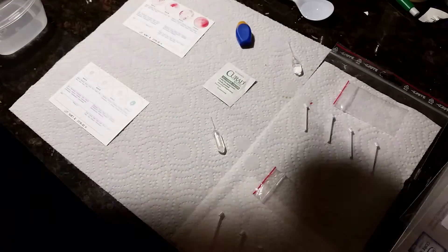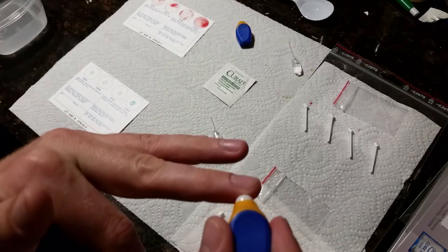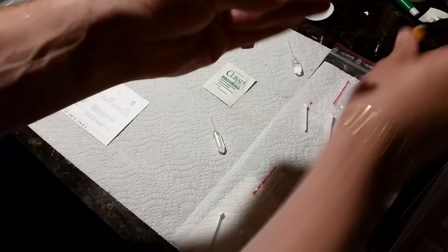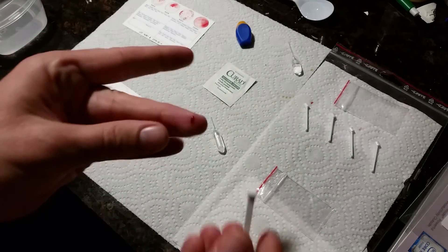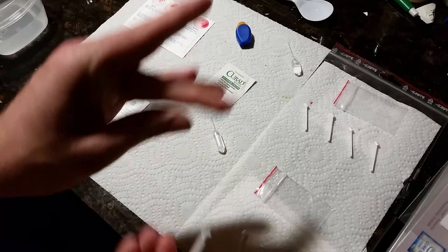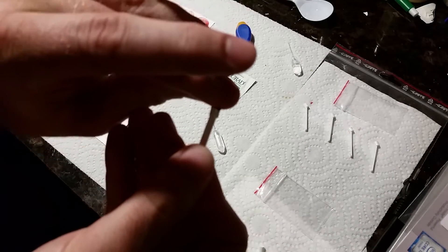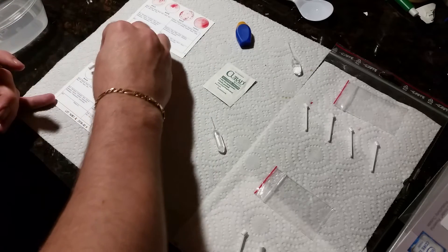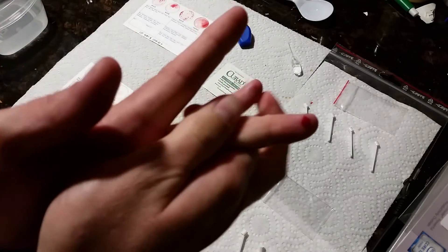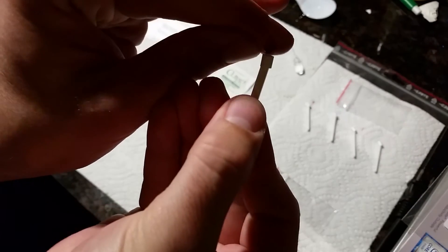I don't see any reflectivity on the finger — it's dry. Going to put it on the side and press. Start massaging the blood out. That's a nice stream right there. I'm just going to grab some of that blood on this first stick here, lay it out nicely, put it in the dot, and let it sit. Get some nice blood flow.